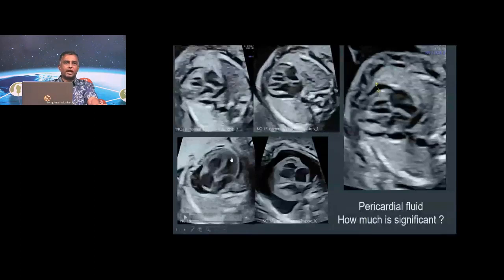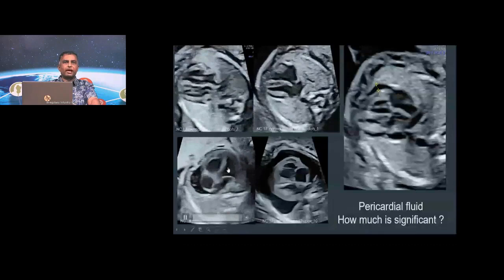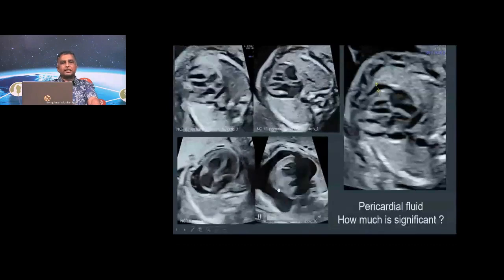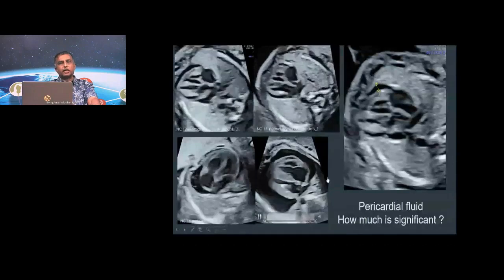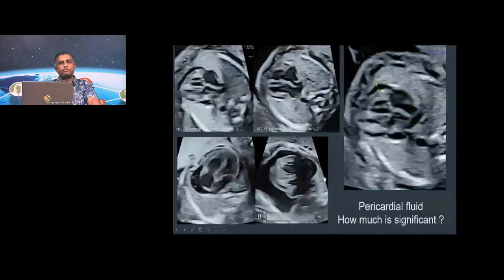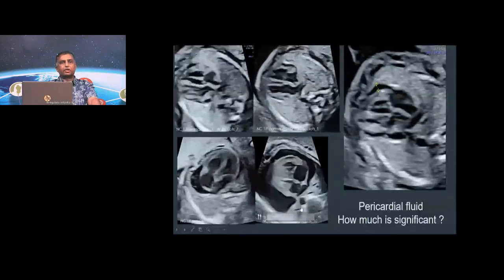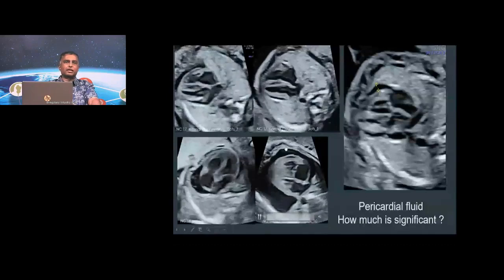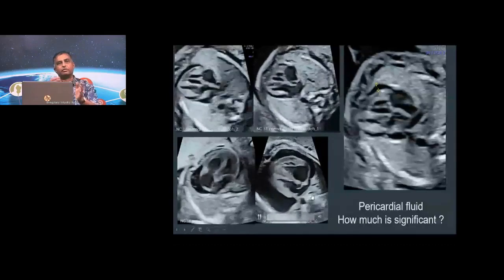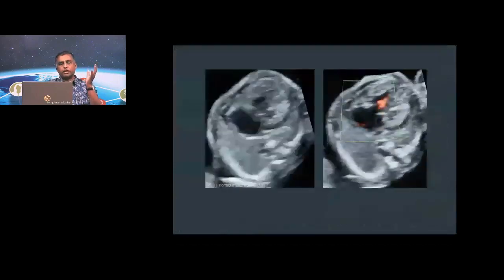The heart also is enlarged. If you carefully look, the heart is definitely enlarged, the cardiomegaly which has happened there. And in this case, of course, it's a huge pericardial effusion. Those are the lungs which are pushed behind. This is not a pleural effusion because the lungs are pushed backwards posteriorly, and this is the heart, which shows a classical rocking kind of movement that you see, a floating heart in a pericardial effusion, right?